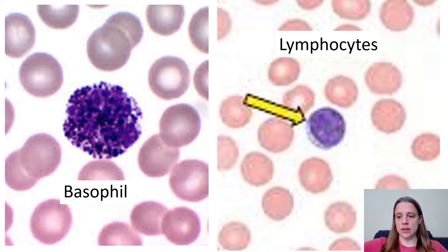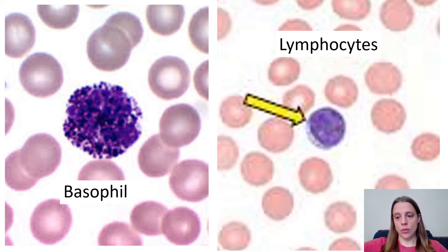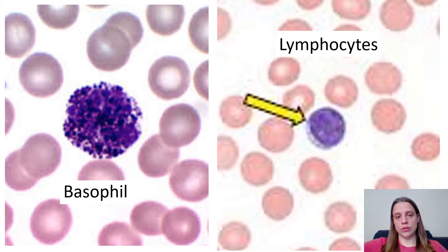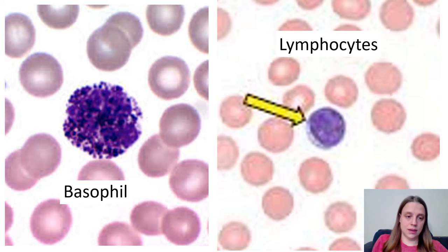Also, in the lymphocyte there will always be some amount of visible cytoplasm. All the dark purple in the middle of the lymphocyte is the nucleus, and that little pale halo around the edge is the cytoplasm — some lymphocytes have a little more, some have less, but there will always be some visible cytoplasm. In the basophil you don't see anything, just dark purple granules.